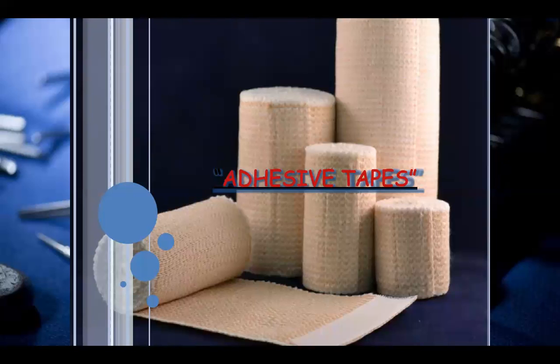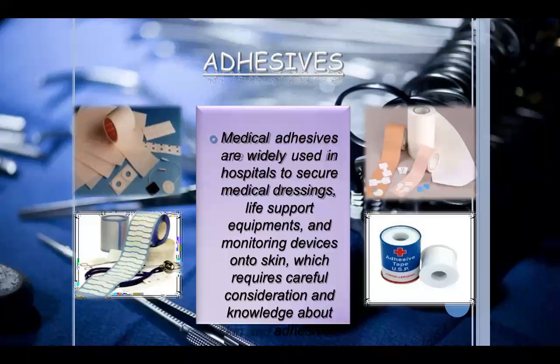Then adhesive tapes. You may have seen these adhesive tapes. Similarly, when there's a smaller cut, you have a bandage. I forgot the name of that one. It's a simple tape that you just place over there, and that is an adhesive. These are all adhesive in nature, because bandages have to be fixed and knotted, fixed with the help of certain things. But these are adhesives, so they fix over the place where you need them.